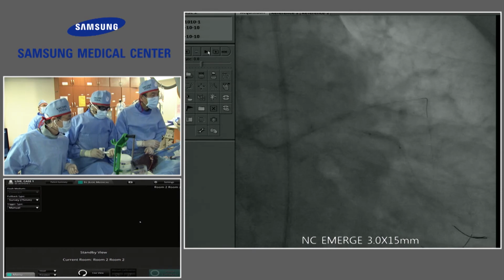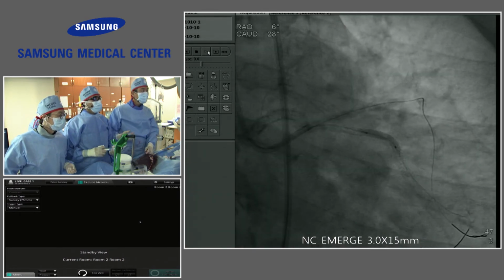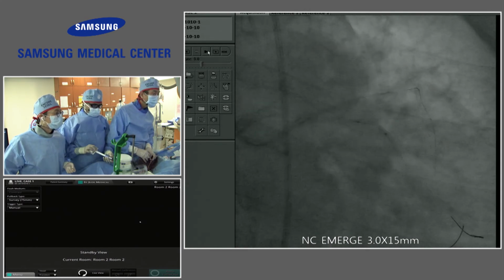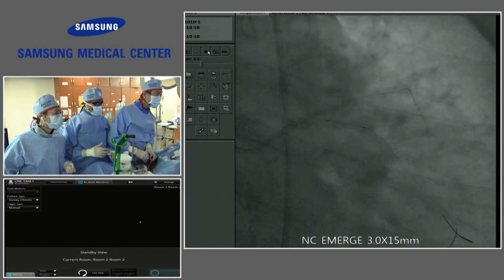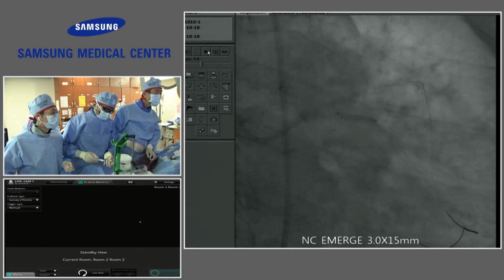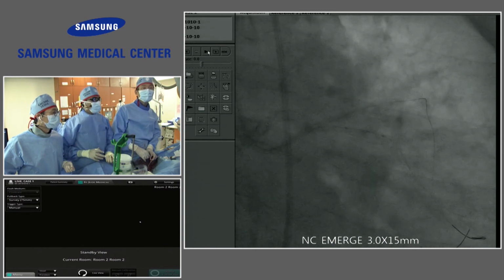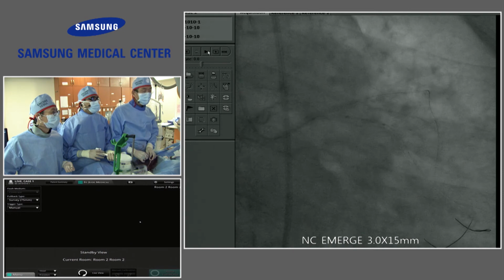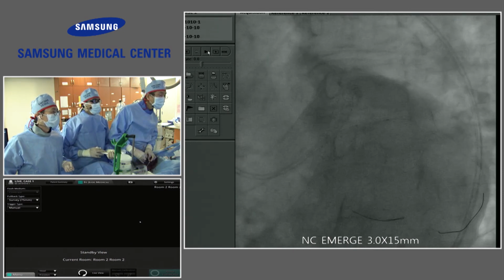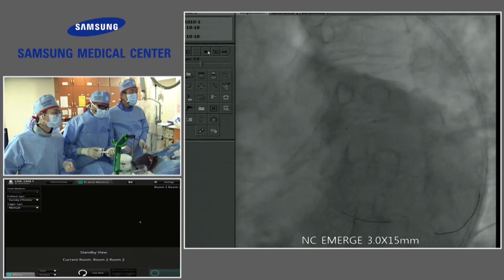Okay, well. Dr. Gwon, this is Dr. Hong. Personally, I prefer the imaging-guided PCI procedure, but I'd like to raise some issues about the timing for the imaging tool. When you look at the angiogram, there is a very severely tight narrowing in the left main bifurcation. When you look at the circumflex, there is very severe calcification, and based on angiographic appearance it is somewhat tortuous.